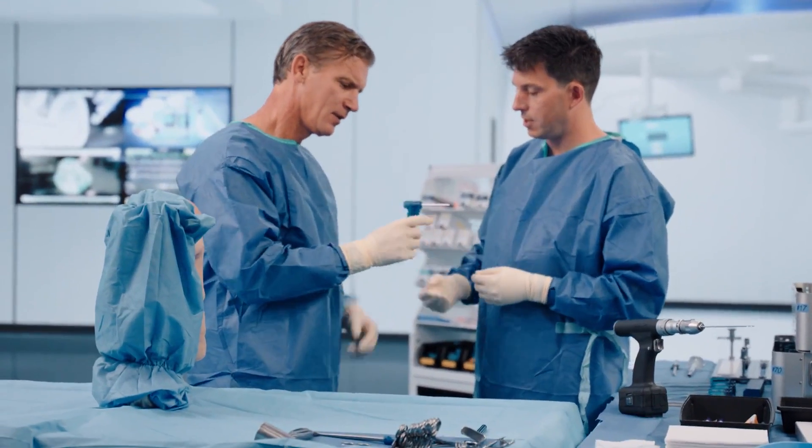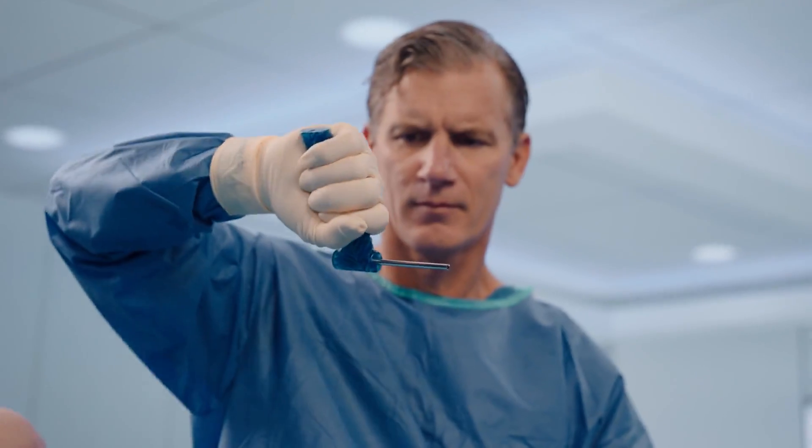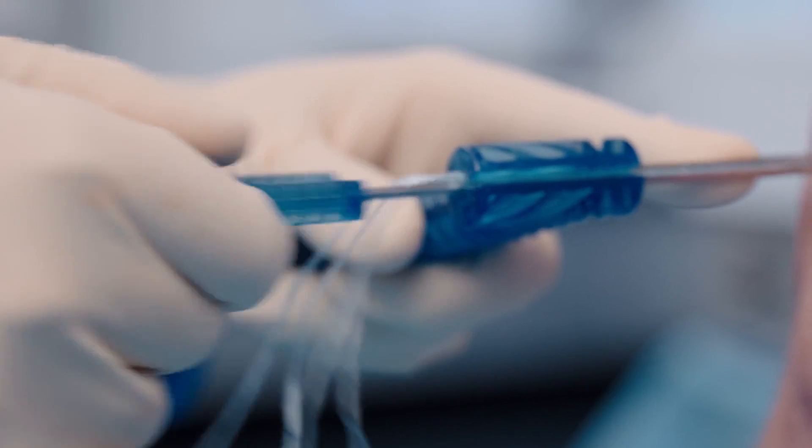You want something that's easy, reproducible, and doesn't have a lot of downside. That's the beauty of this device — it's easy to deploy. There's a hole, you stick it through it, you stick your graft through it, and you pull on it and it tightens it down.